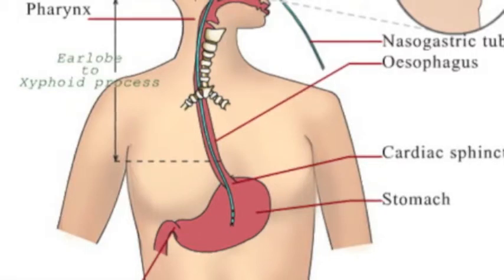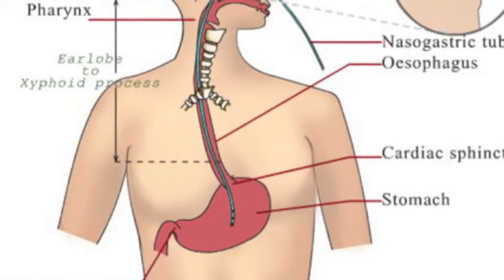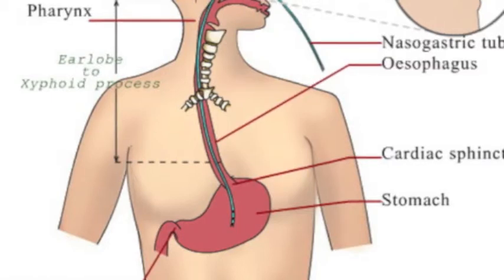I don't know what this part is called, but it's the top of the ear. This is the lobe. You're going to the top of the ear, because you really can't see. This is like a cross-sectional visual view. You really can't see where the xiphoid process would be.